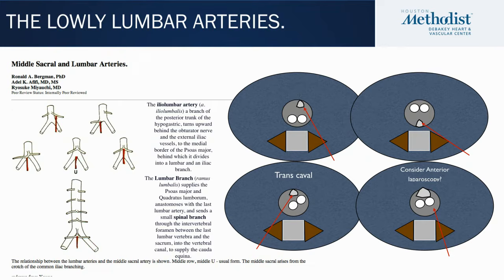Obviously, we only approach it if the aneurysm is getting bigger. And our approach depends upon the configuration of that aneurysm. Where is the endograft sitting, and what is the target vessel? So for example, in the top left, you can see we're looking for an IMA source. The endograft is posterior. We can approach it translumbar from the left.